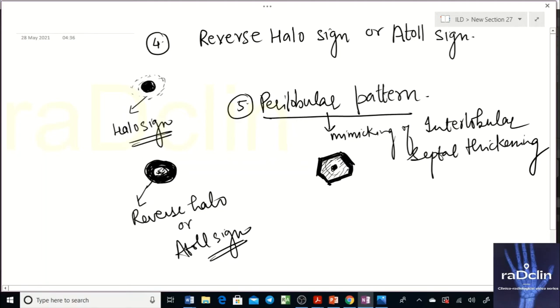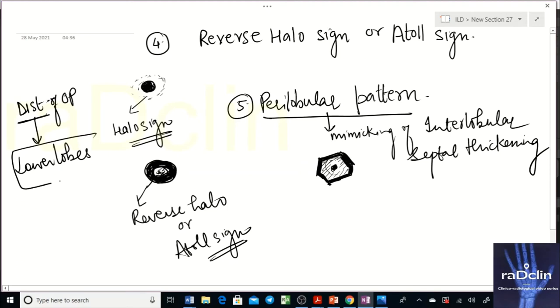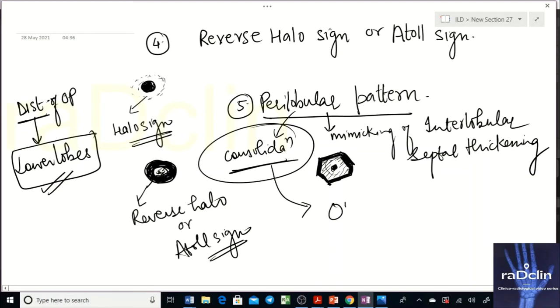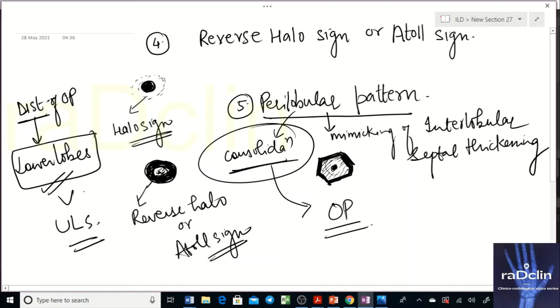The distribution of organizing pneumonia commonly involves the lower lobes. If you see a perilobular pattern with lower lobe involvement, it may mimic NSIP. However, in NSIP the typical finding is GGO, whereas in COP consolidation is more classical. Also in NSIP the gradient is lost, while in COP lower lobes are involved more than upper lobes.